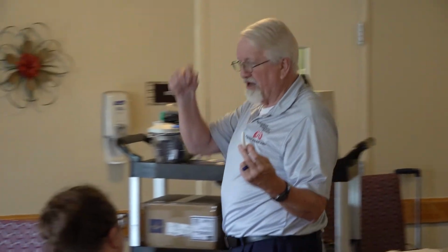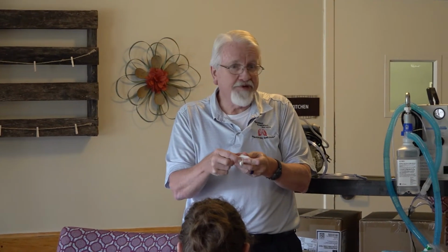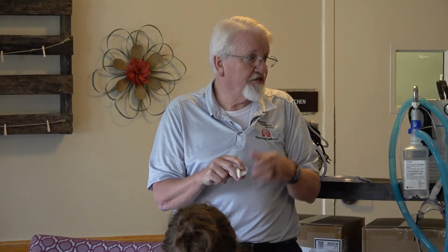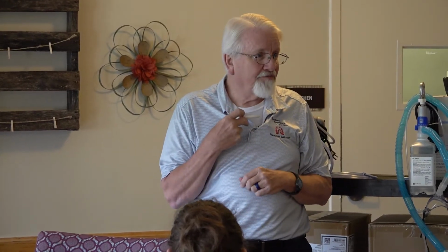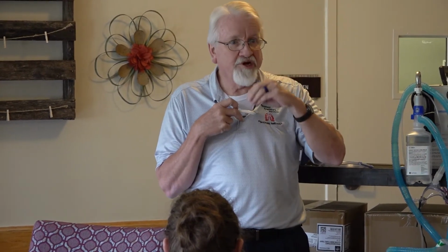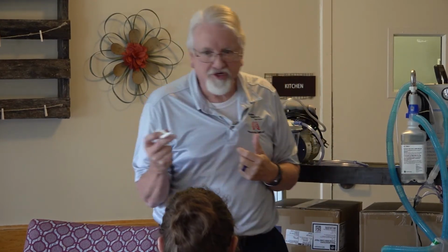Nice, smooth, rounded. And believe it or not, if I've got tissue or something that has fallen down over the opening in the airway, I can actually feel my way up the airway till I find the hole. I have had several patients in the past that, once you pull this out, you weren't going right straight back in. You actually had to start below it and work your way up, because you're kind of pushing the tissue out of the way until you get to the hole.